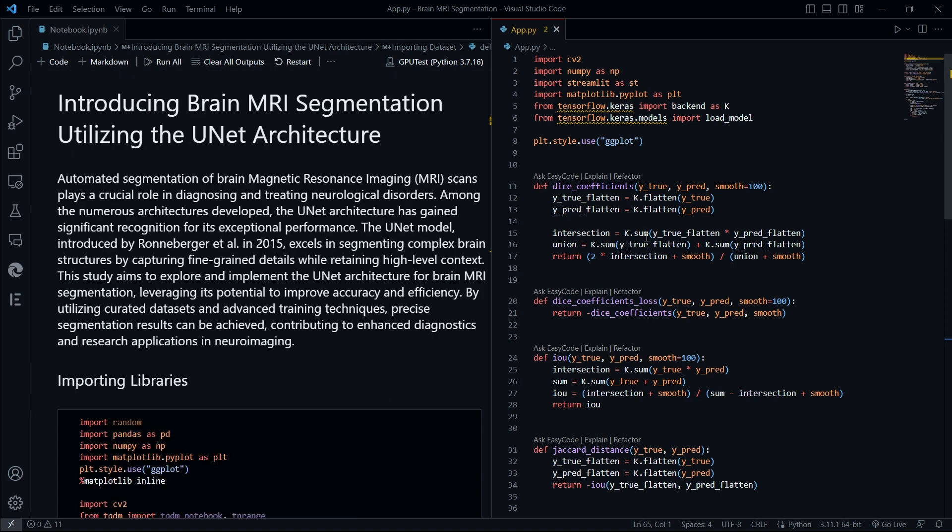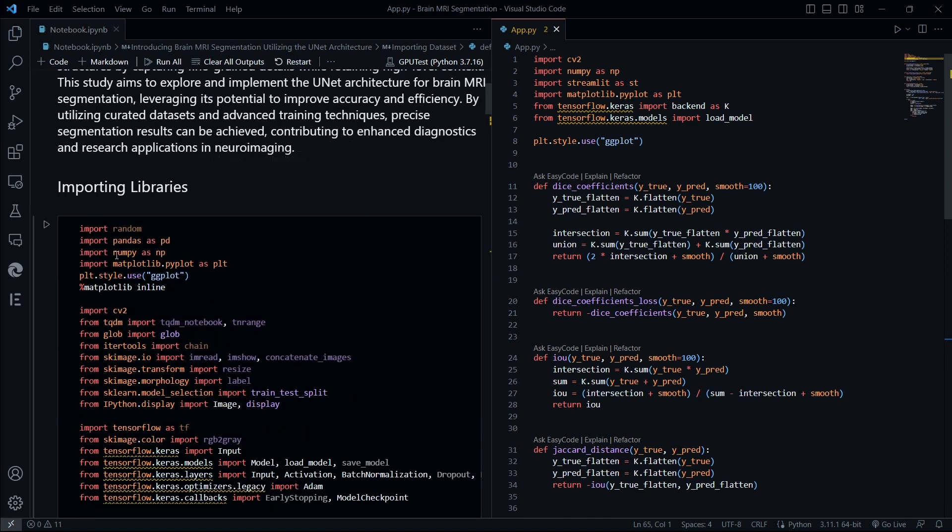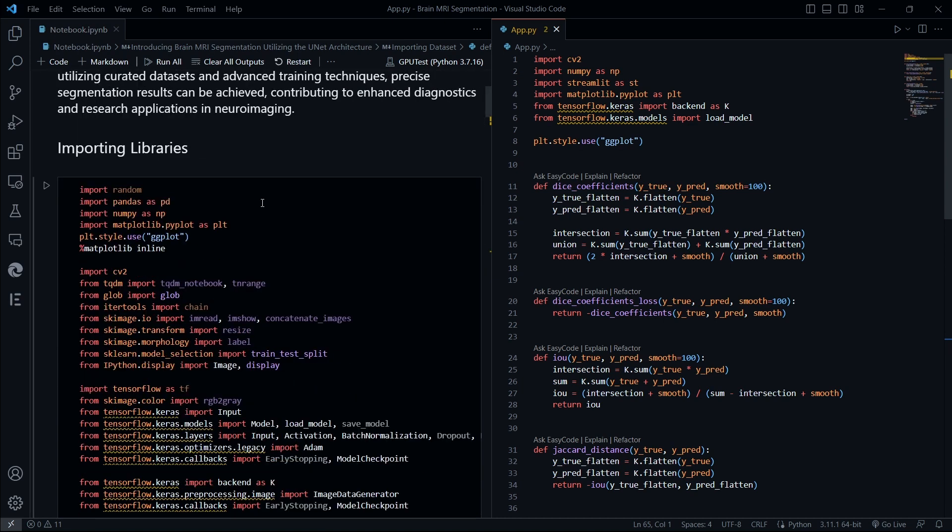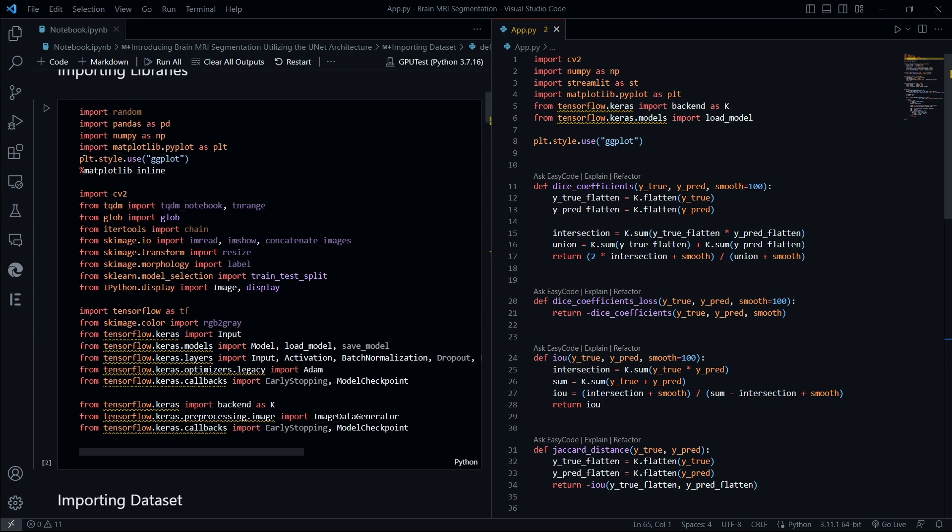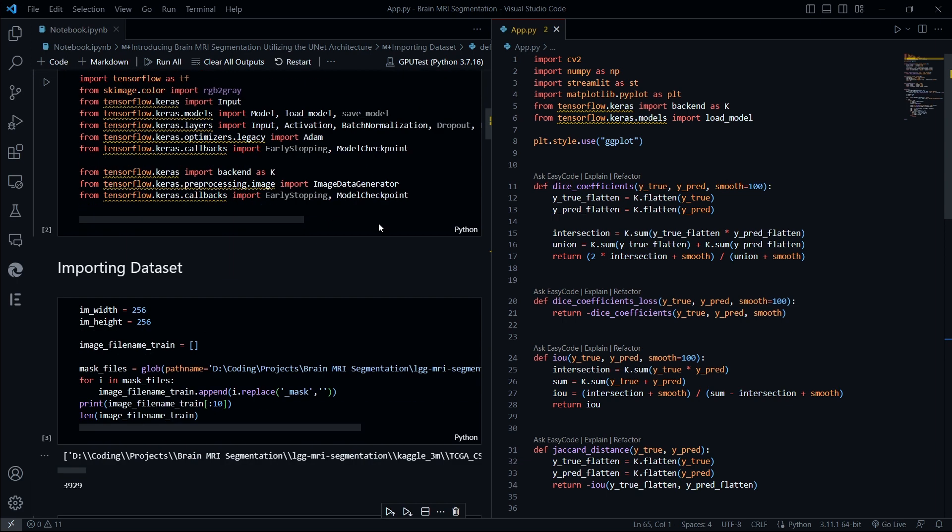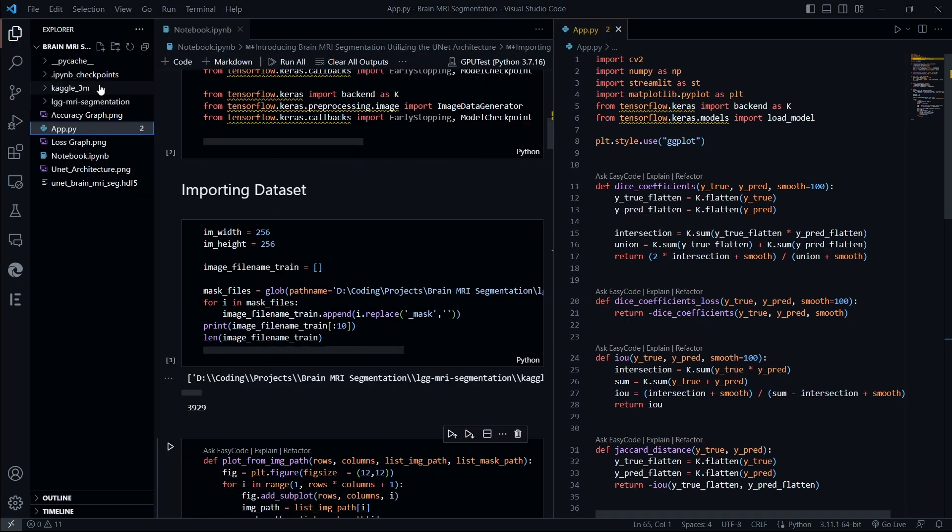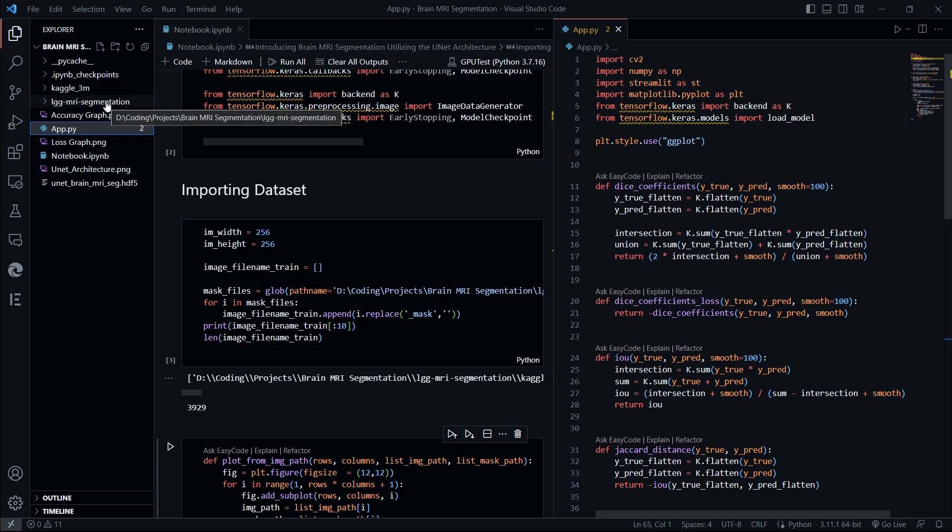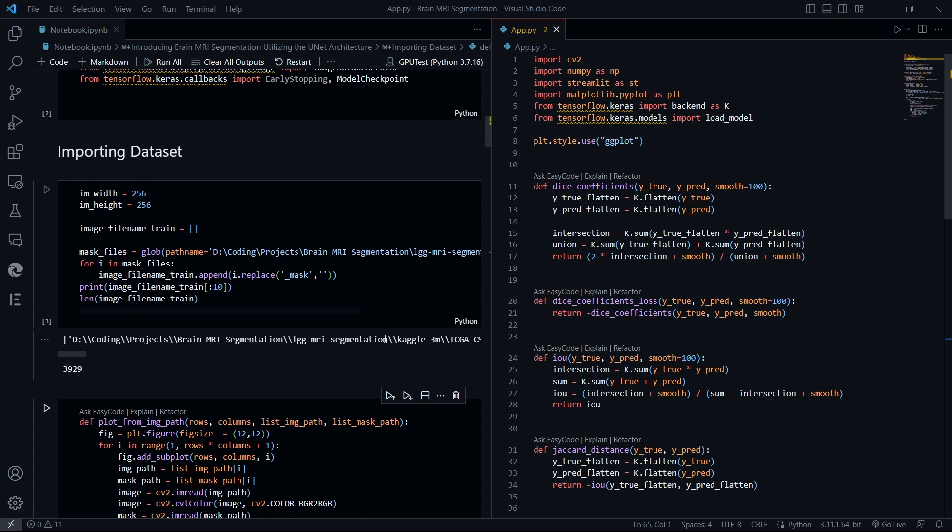So let's go to the model implementation that we can see over here. This is our Jupyter notebook named notebook.ipynb, which stands for IPython notebook. Here we are importing all the libraries including TensorFlow, CV2, and scikit-learn and many more. We're importing the dataset, the LGG MRI segmentation that has been downloaded from Kaggle, which I will show you in the full tutorial video.